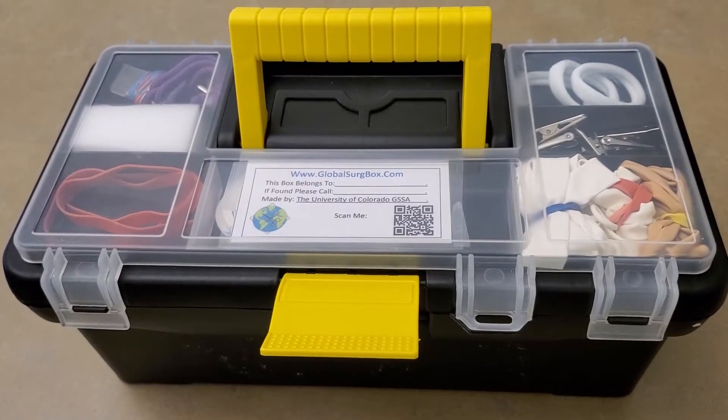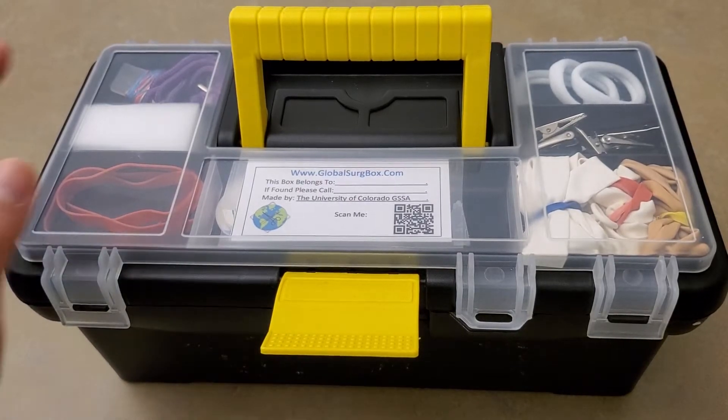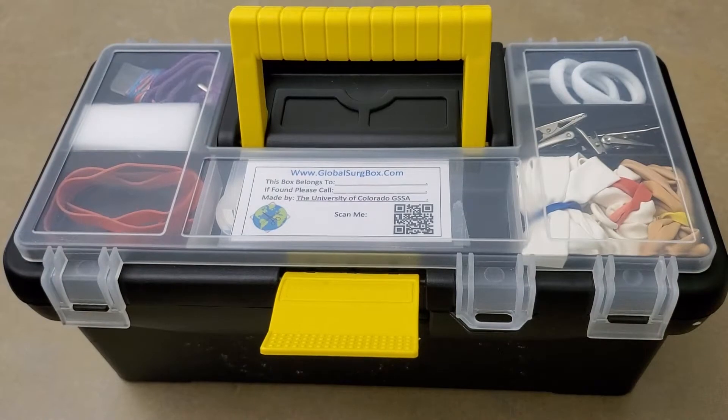Welcome to the GlobalSurgBox. This is a surgical simulator that is extremely affordable and portable, and everything you need to practice or teach a skill can fit in this 12.5-inch toolbox. Today I'm going to give you a quick overview of what's in the toolbox.